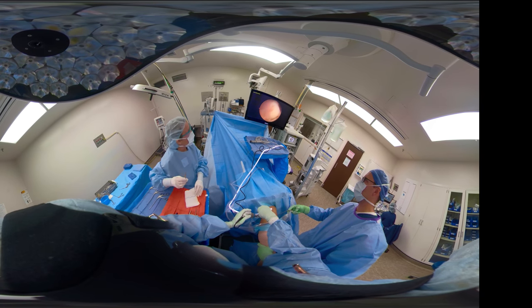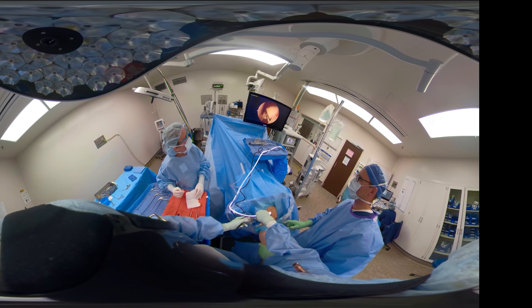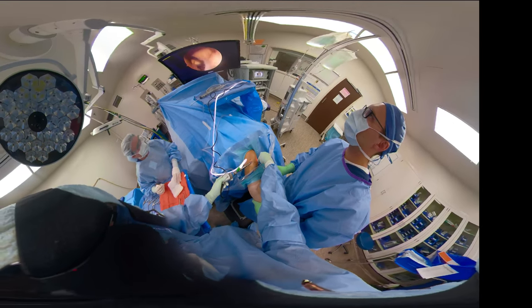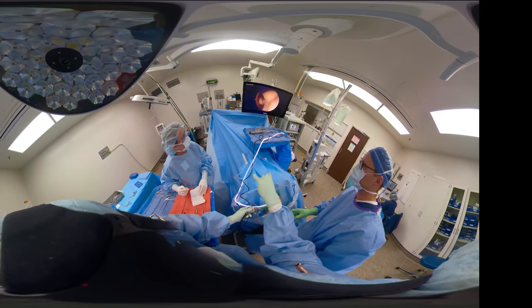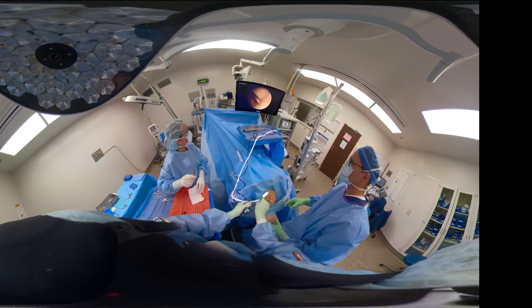This is a pretty big loose body, measured like 2 by 1 centimeters, and you can see there's no bone on that loose body, so it's all articular cartilage. So he's got the scope lateral. He's got a pretty good bite of it, but we can maybe get a little better bite.